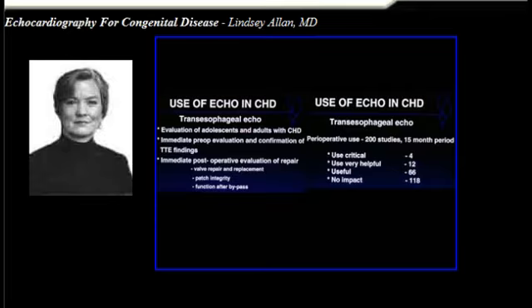And immediately post-operatively, it's important for evaluation of the repair, and that is particularly important in the setting of valve repair or valve replacement, to look at patch integrity and to also look at function as the patient comes off bypass. We looked at a series of 200 TEEs that we'd done over a 15-month period to try and evaluate just how useful it was in practice.